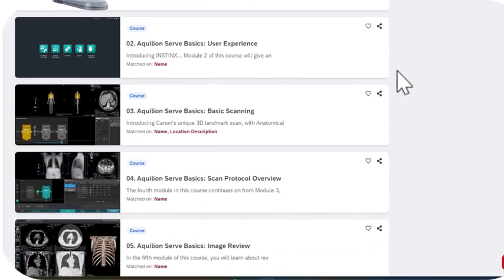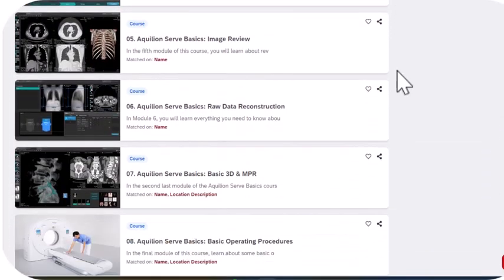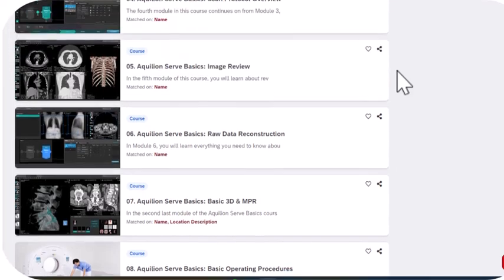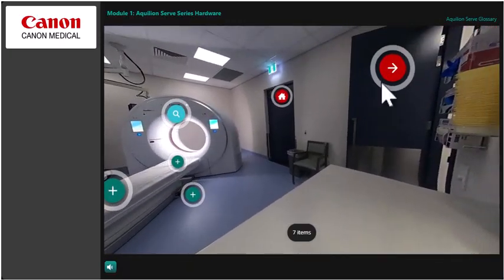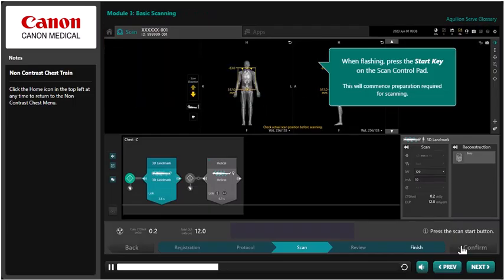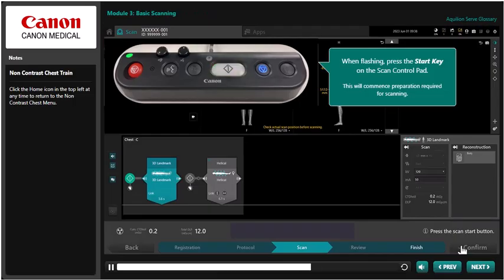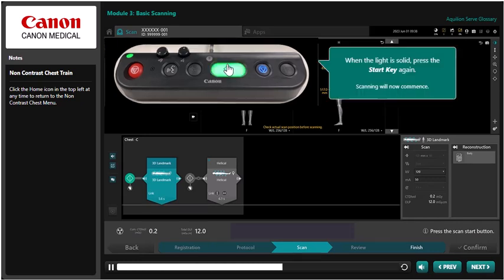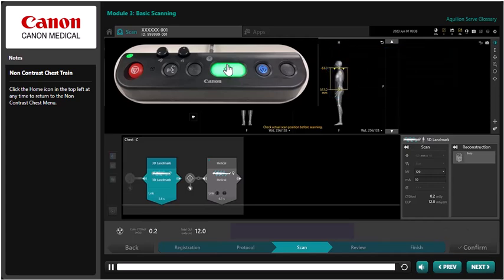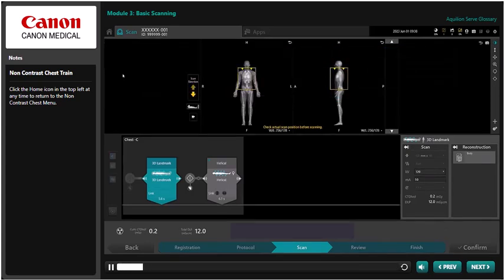Each module has custom-designed interactive experiences that mimic real clinical scenarios. This includes 360-degree virtual tours of the scanner and simulated scanning and raw data reconstructions. For increased accessibility, each module contains closed captions and optional exercises for both basic and advanced users.